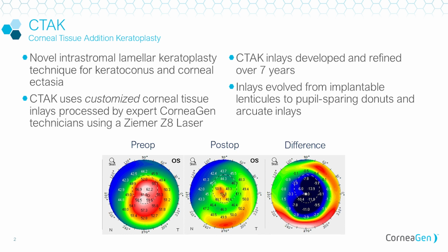We'll go into it again in greater detail, but just looking at the corneal topographies that you see here, we've been getting profound flattening effects. Most importantly, we're able to make the corneal topography much more symmetric, which we'll see in our clinical trial has led to really good vision outcomes, topography outcomes, and patient satisfaction.